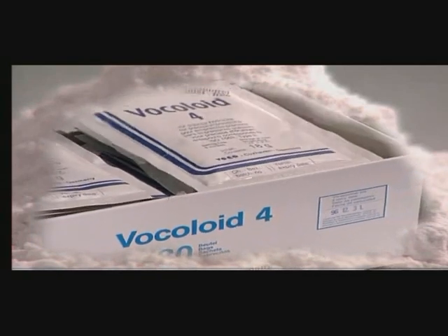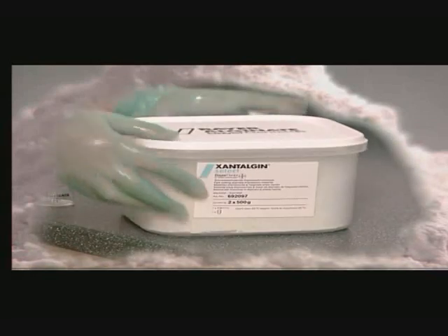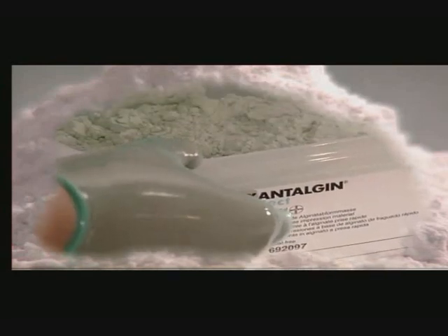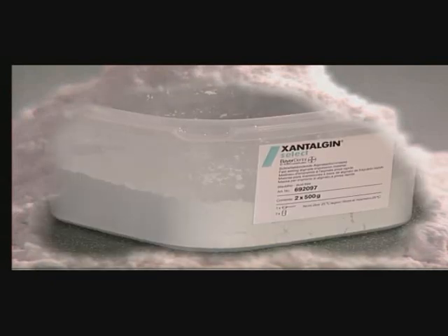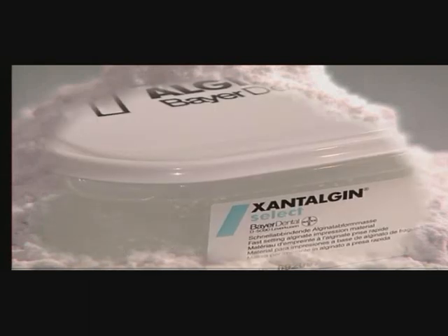On one hand, a processing-friendly, ready-made version portioned into tightly sealed individual bags for fast and safe mixing. On the other, alginate is offered in the economical storage jar. Always shake well before opening, because the powder's individual ingredients are easily segregated due to their different weights. The aforementioned dosage must be followed exactly so that the material properties are not altered. The container must be resealed immediately, because the admission of atmospheric humidity influences the powder's properties.